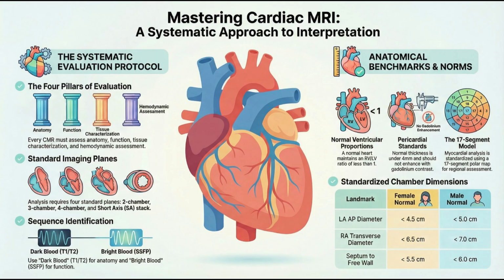There's one final thought I want to leave you with, something that really struck me reading this guide. We spend so much time looking at these static gray screens, and we talk about slicing the heart. But the physiology we're describing is just so incredibly dynamic. The fact that we can null the signal of blood just by timing a pulse to its velocity, it's mind-bending.